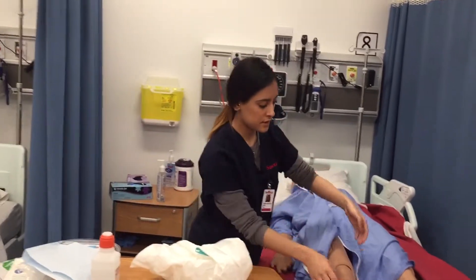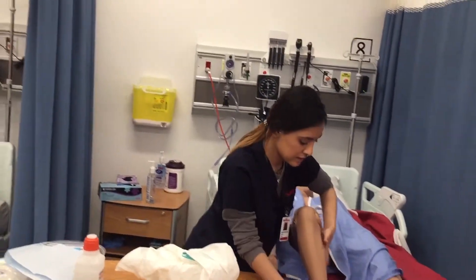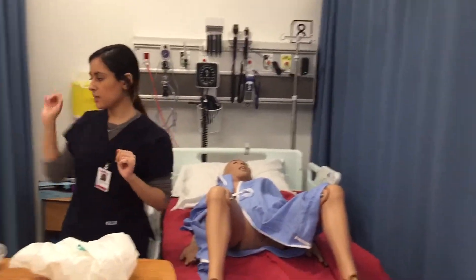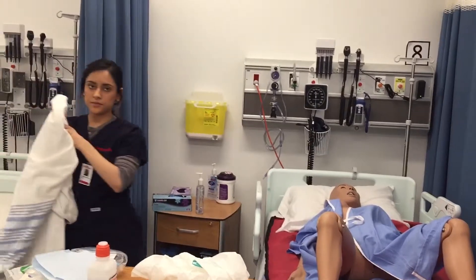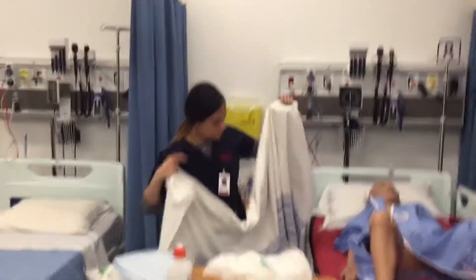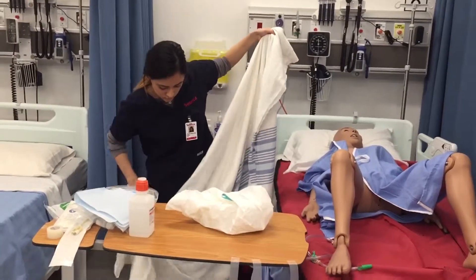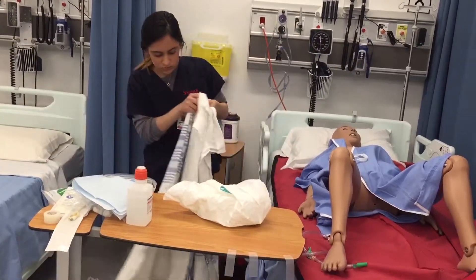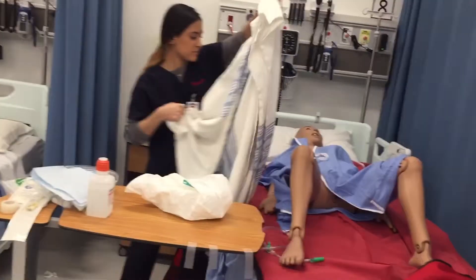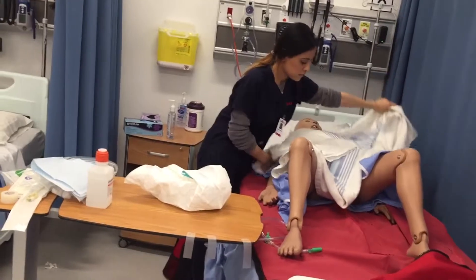I'm going to put my patient in the dorsal recumbent position. Now we're going to bring it in and get set up.